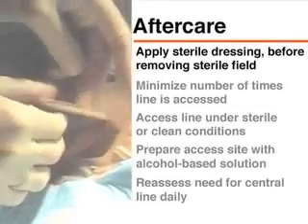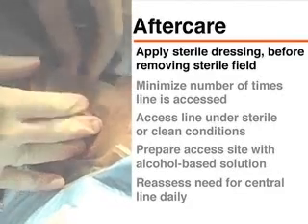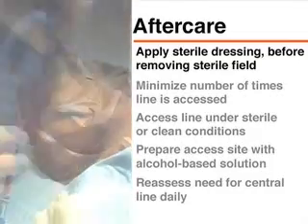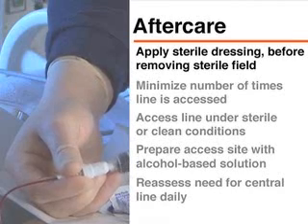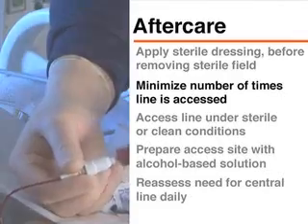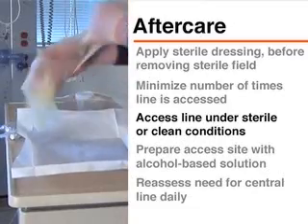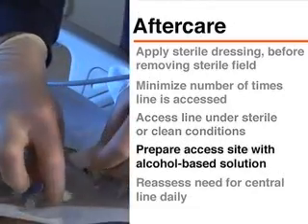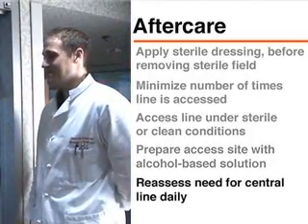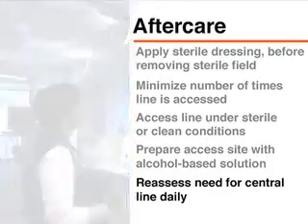A sterile dressing should be placed on the insertion site. The dressing should be changed daily, and whenever blood or liquid accumulates or it loses its seal. In order to minimize the potential for infection in the central venous line, the following precautions should be observed: the number of times the line is accessed should be kept to a minimum, and each time the line is accessed, this should be done under either sterile or clean conditions. The access site should be prepared with an alcohol-based solution. There should be a daily assessment to determine whether the central line is still needed, so that it can be removed as soon as it is no longer necessary.